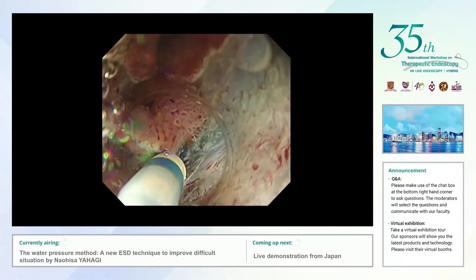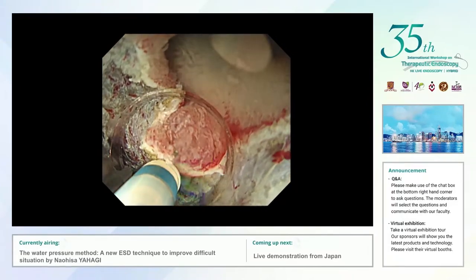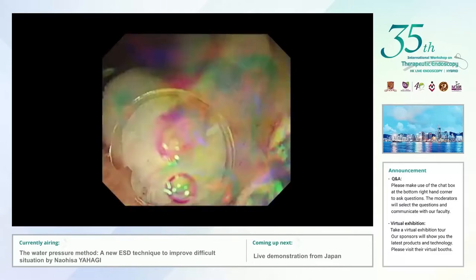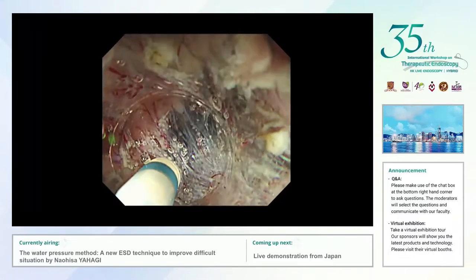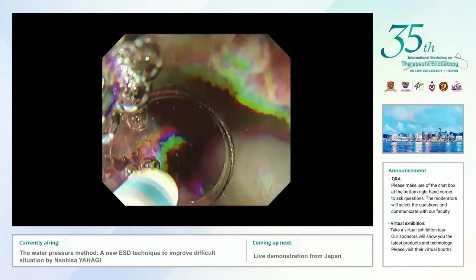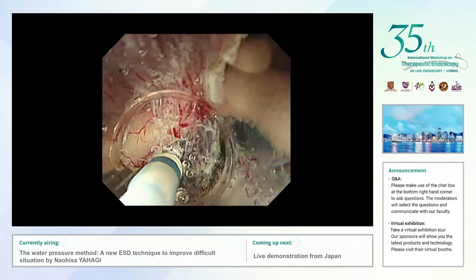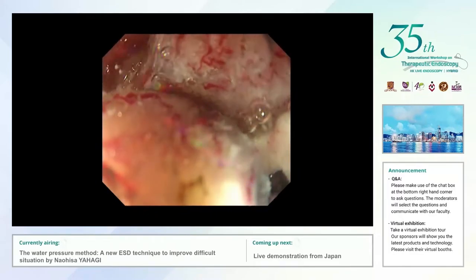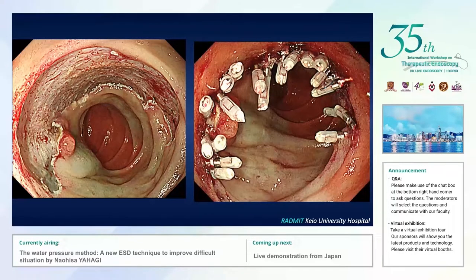I carefully checked the remaining submucosal tissue just beside the major papilla. It was a very difficult situation, but fortunately I could preserve the entire major papilla. After finishing the major papilla side, I continued submucosal dissection using the water pressure method. The remaining submucosal tissue was easily recognized by active pressure of normal saline, and I quickly finished the resection. We collected the resected specimen, and of course we completely closed the mucosal defect using the string clip suturing method.